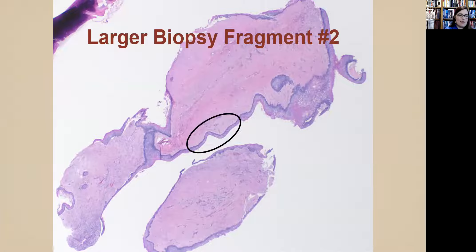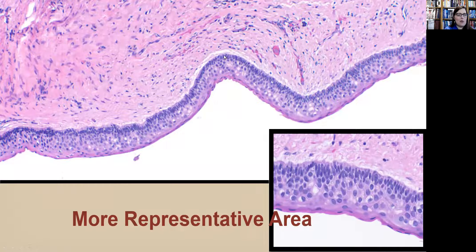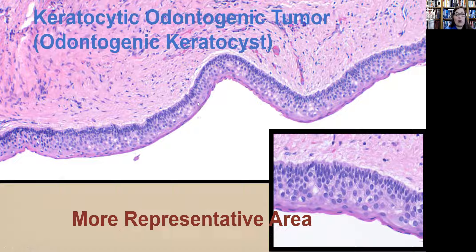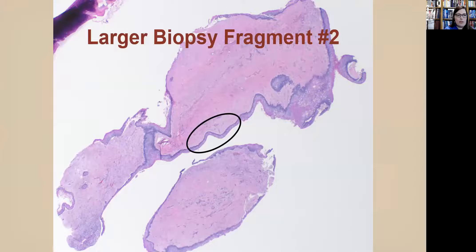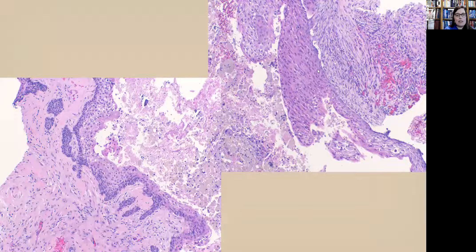Here's the other fragment — and now you probably know the diagnosis. We see separation, a hyperchromatic palisaded basal cell layer, and wavy surface parakeratin. We are dealing with a keratocystic odontogenic tumor (KCOT). The point is that inflammation obscures the features of OKC/KCOT. In retrospect, it is easier to pick up KCOT in the inflamed area, but you need to be aware that inflammation can be a pitfall in your KCOTs.